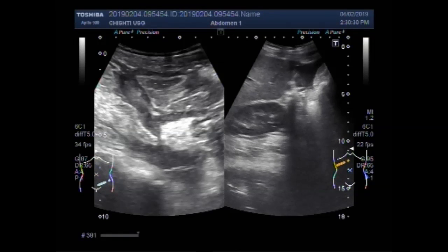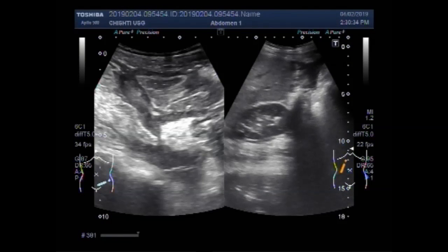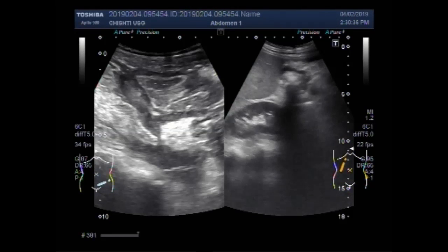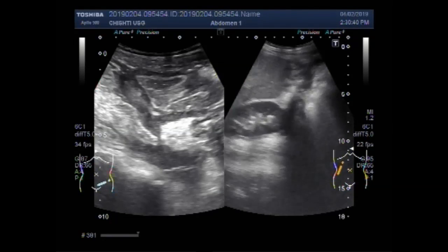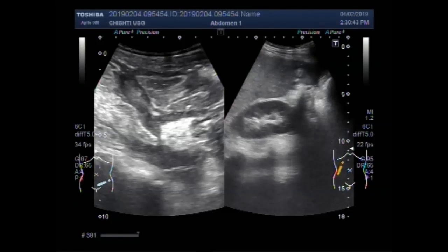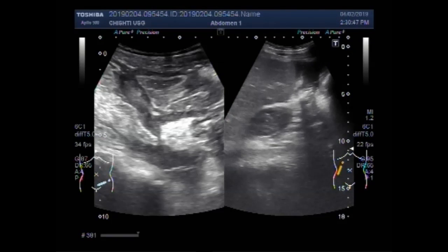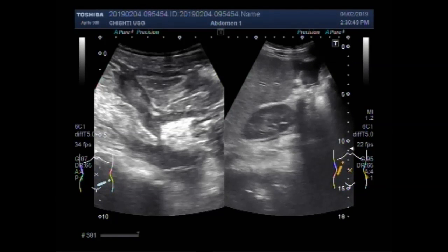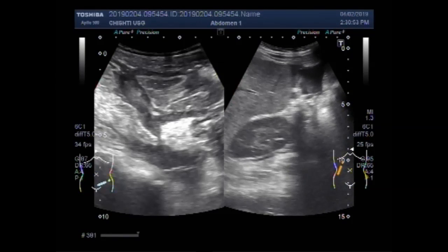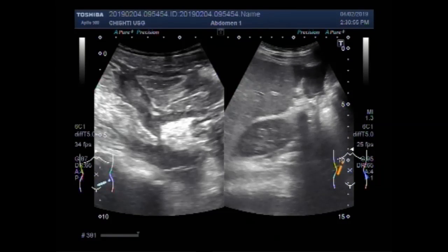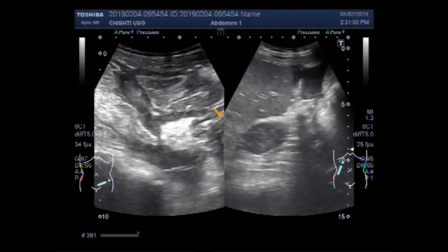This is free fluid seen in the upper abdominal cavity. There is extensive free fluid visible throughout the upper abdominal cavity in multiple views.